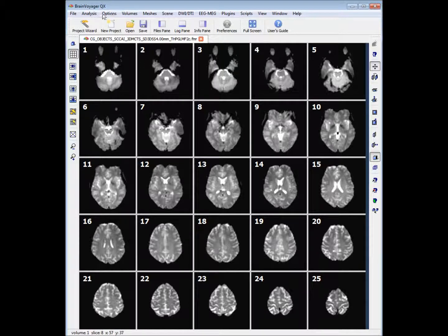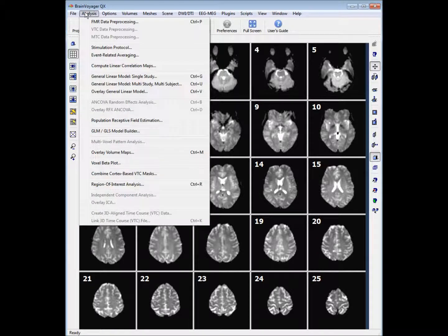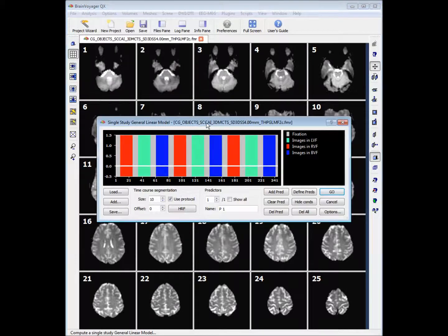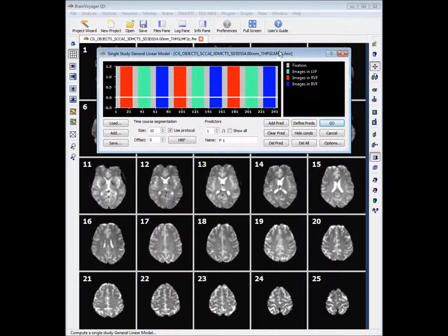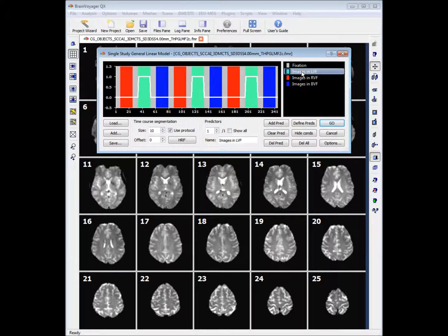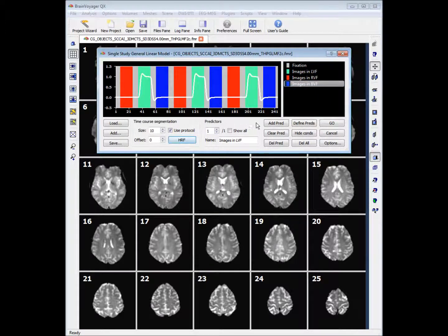To get started, the first thing we want to do is create our model. We'll go into Analysis and General Linear Model Single Study. We'll be presented with this window. We want to define what our predictors are. If we right click on Images in the Left Visual Field we'll get this boxcar function again. We want to apply the hemodynamic response function to the boxcar function. Then we want to add our second predictor.